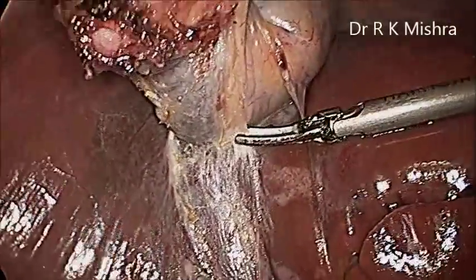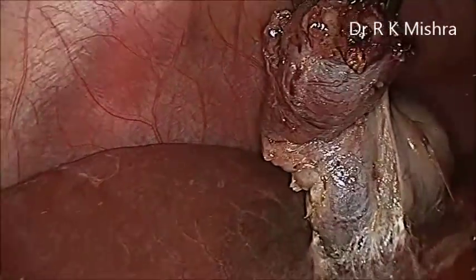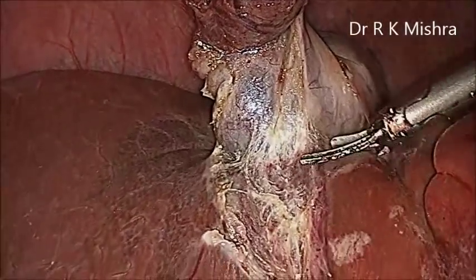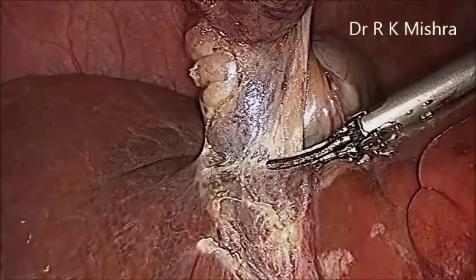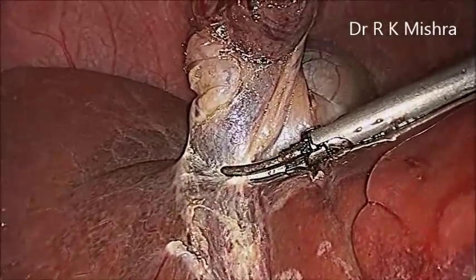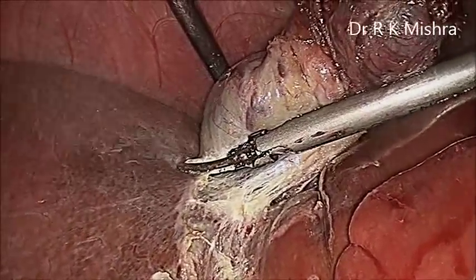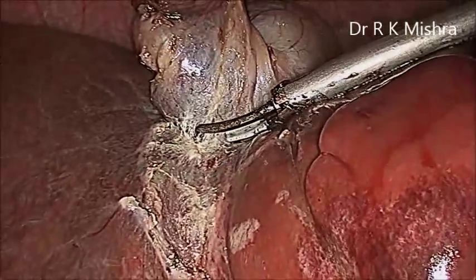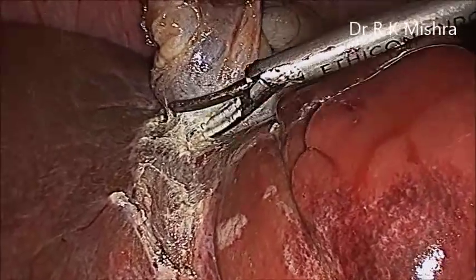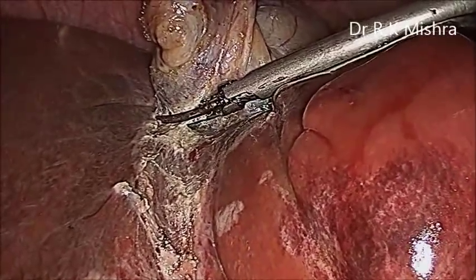Here the light cable of the 30 degree telescope, if you keep it down, it will be very useful. Here we are guiding the assistant to put the light cable down, and now the vision is good because it is showing you up, and then slowly you can see the areolar plane better. This is again anteromedial traction, again anterior traction, and then slowly anterolateral traction. So this way you can completely separate the gallbladder from the gallbladder plane.